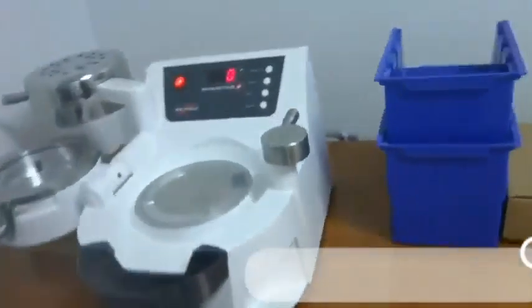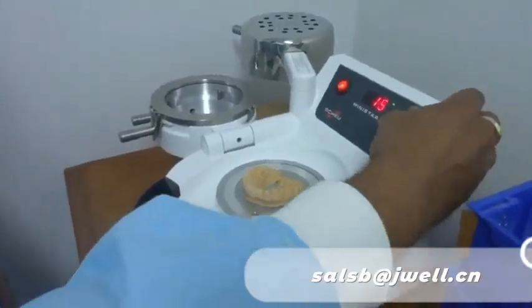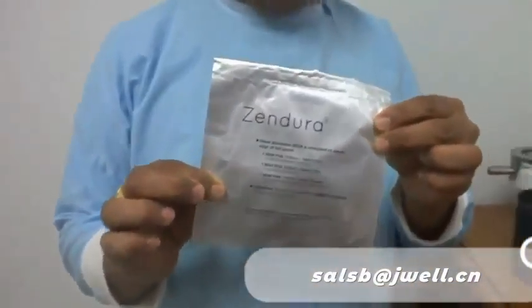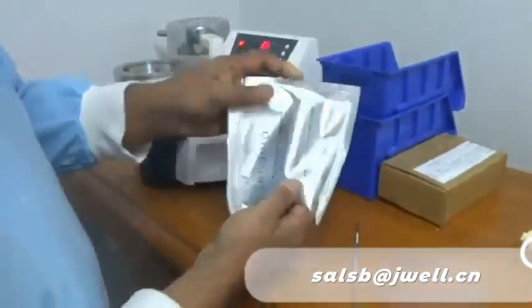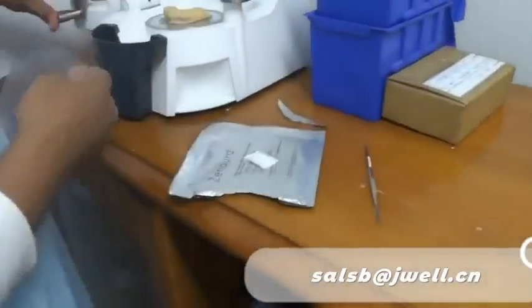So we come over here, and this is our mini star machine that we purchased, and we just basically put it down on that section. We're using Zenduro blanks, and we select 35 seconds of heating cycle. Here's the Zenduro blank. They come individually packed, so you've got to open these up, but don't open them up too early. Open them up as you need them, because they do absorb moisture and can go bubbly. So here's one of those gel packs inside to take the moisture away.